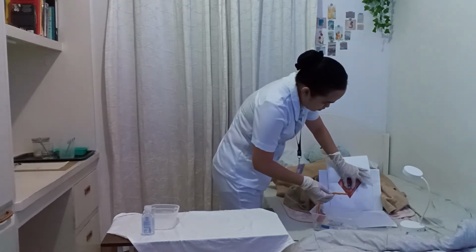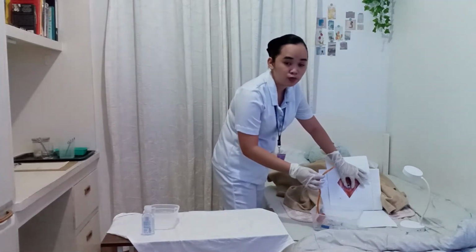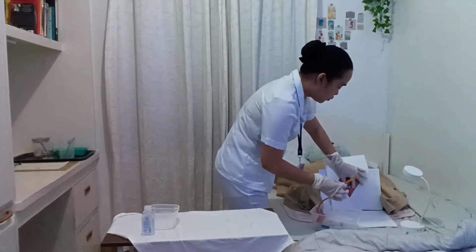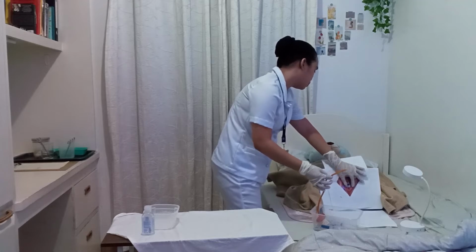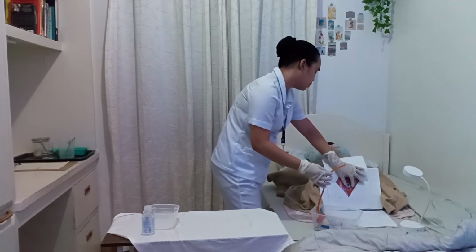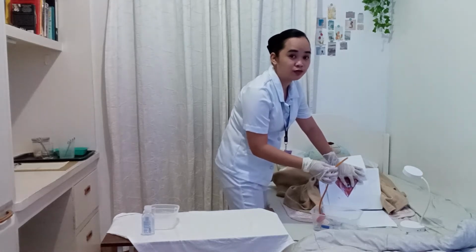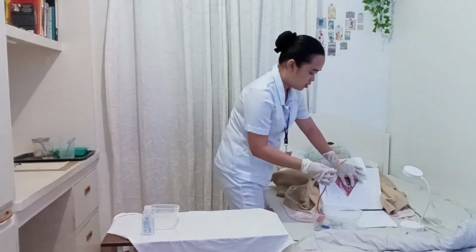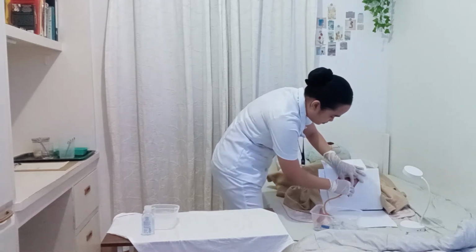Okay. So now, insert the catheter on the patient's meatus for about 2 to 3 inches or until the urine will begin to flow. So ma'am, I'm now going to insert the catheter, so I need you to stay relaxed, and if you feel uncomfortable, just tell me, okay? So the female urethra is approximately 1.5 to 2.5 inches, and relaxation of the external sphincter will allow the easy insertion of the catheter. Okay, so now ma'am, I'm now going to insert the catheter, so just stay relaxed, ma'am.